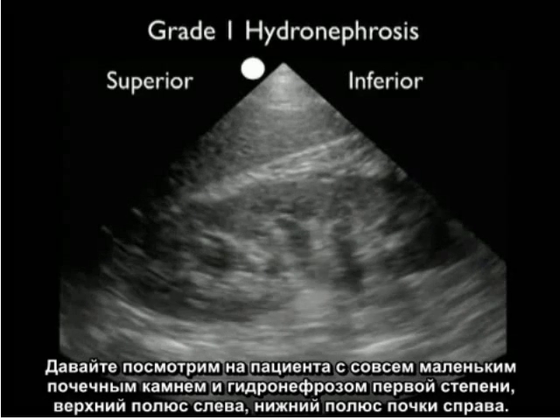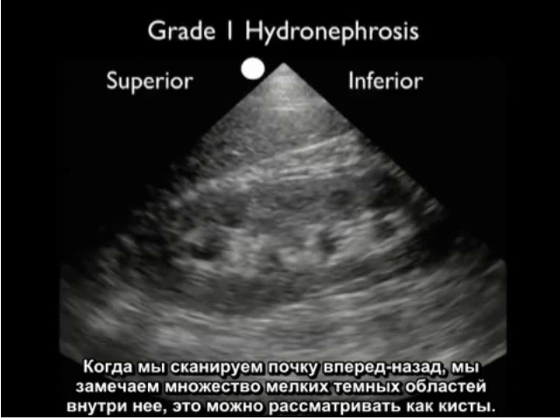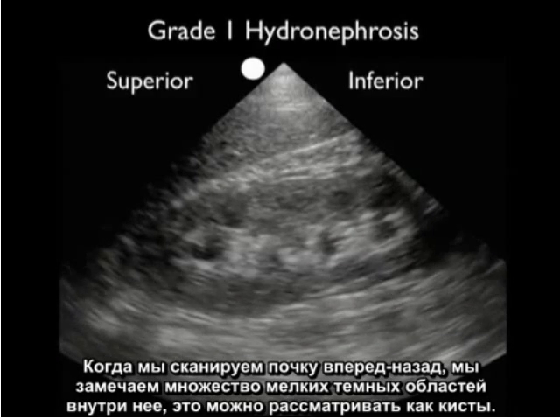Let's begin by taking a look at a patient who presented with a very small kidney stone and grade 1 hydronephrosis. Superior pole to the left, inferior pole of the kidney to the right. As we scan back and forth through the kidney, we note multiple little dark areas within the interior of the kidney. These could be construed as cysts.